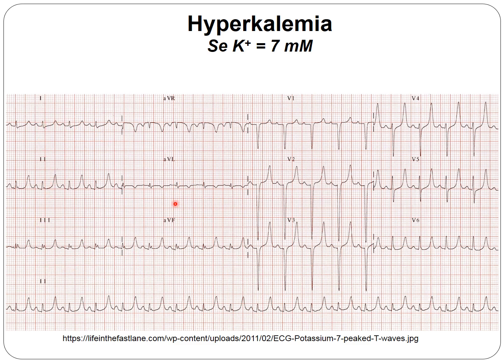By looking at the QRS complex, next we are looking for the pathological Q wave. Here in V1, V2, V3 we can see it, and the R wave progression is very slow, because normally the transition occurs between V3 and V4. However, here we have it between V4 and V5.